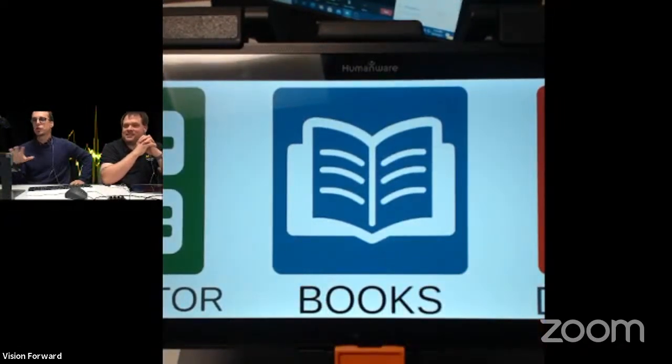Now this software is on a few different devices, not just the Connect 12. And I'm going to show you another device as well after this. So they have been going with this for a little while. The first device they introduced it on was the desktop, which is called the Prodigy. Yeah, and it had a little tablet that popped in. It was actually a clever design. I don't think it sold terribly well. I think this design makes more sense than that first one.